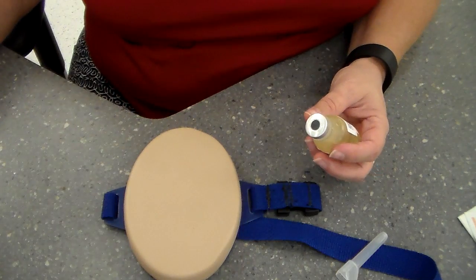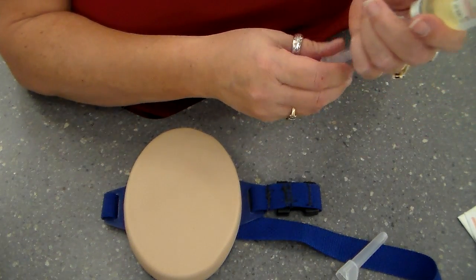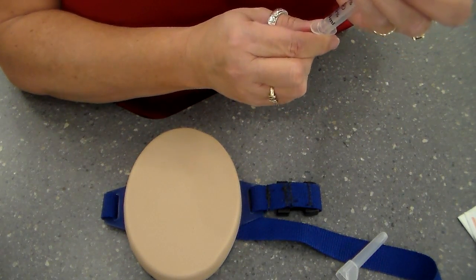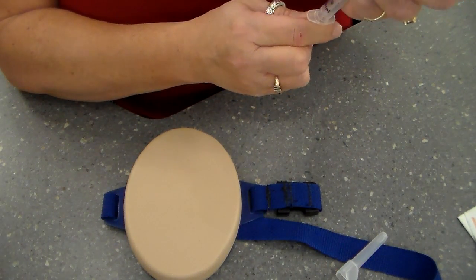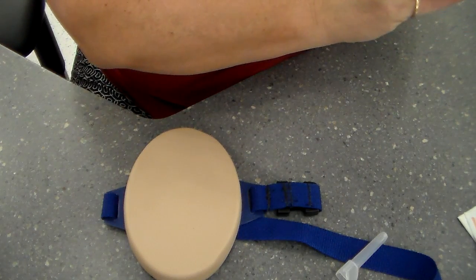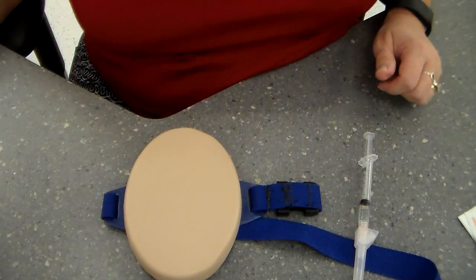All right. So we're going to prepare the correct dosage inside of the medication room. I'm just going to draw back. I've already showed you how to take medicine from a vial, so I'm not going to do that here. I'm just going to show you how to administer it. I'm just preparing it so that we can do it. This particular medicine is going to be a 1 milliliter injection into our patient.